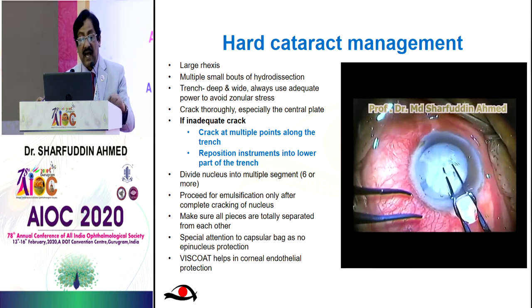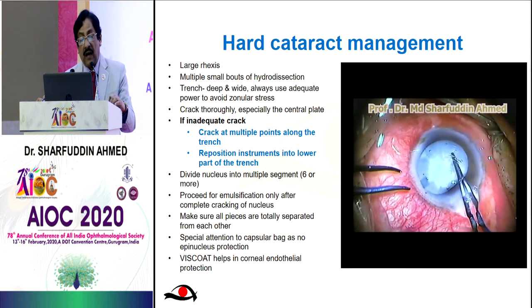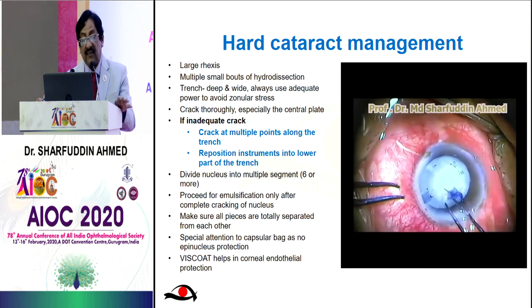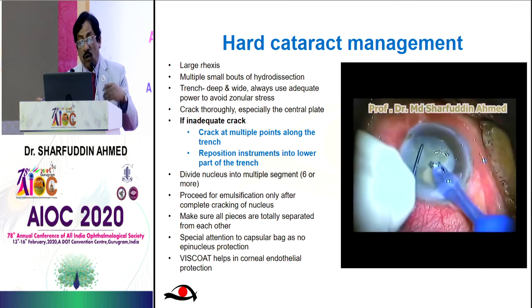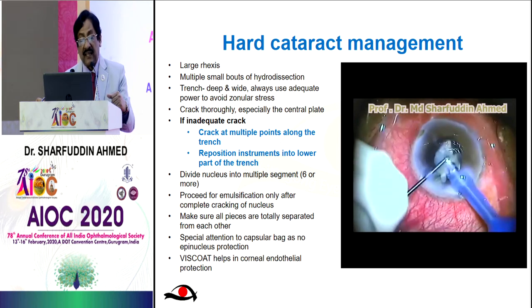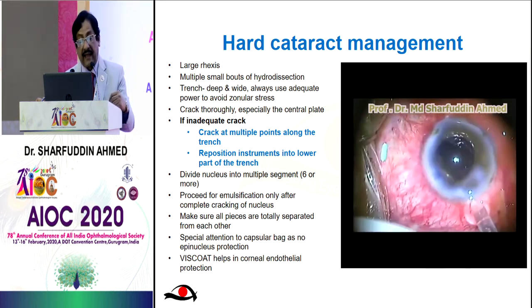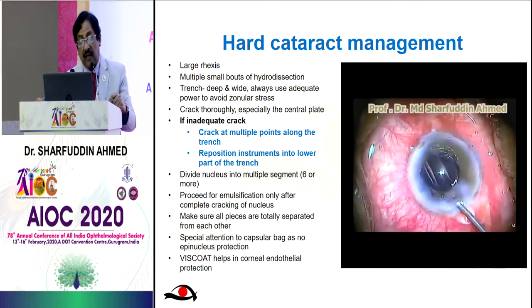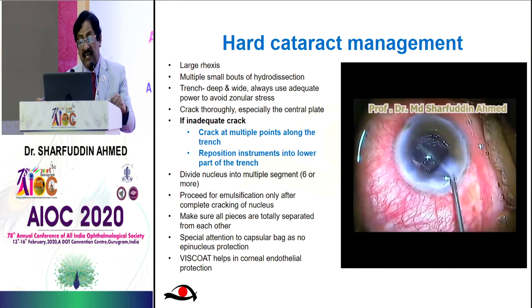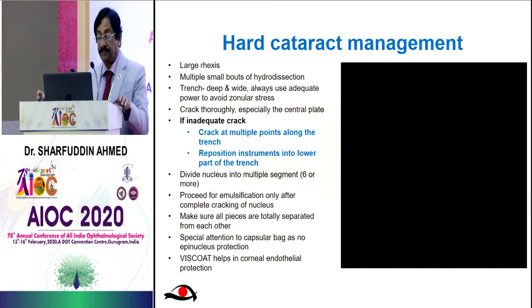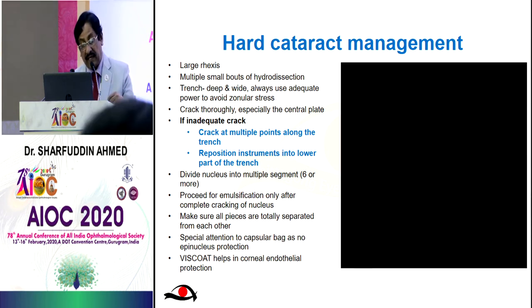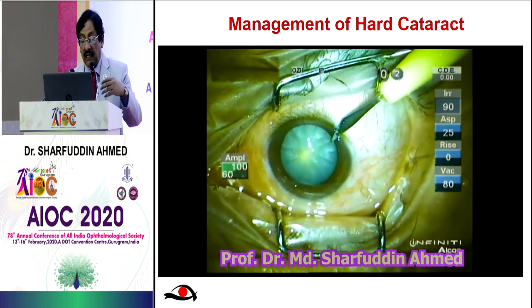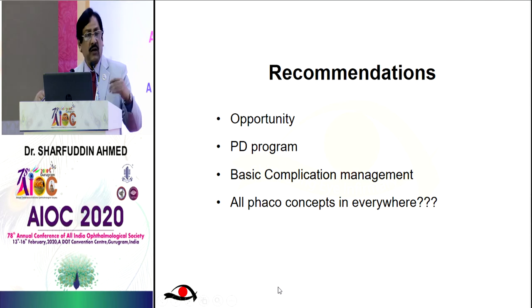In hard cataract, a large rhexis is a must, with multiple small bouts of hydrodissection. Trench deep and wide, always using adequate power to avoid zonular stress. Crack thoroughly, especially the central pole — even with an inadequate crack, crack at multiple points along the trench and reposition instruments into the lower part of the trench. Divide the nucleus into multiple segments, proceed for emulsification, and make sure all pieces are totally separated from each other.